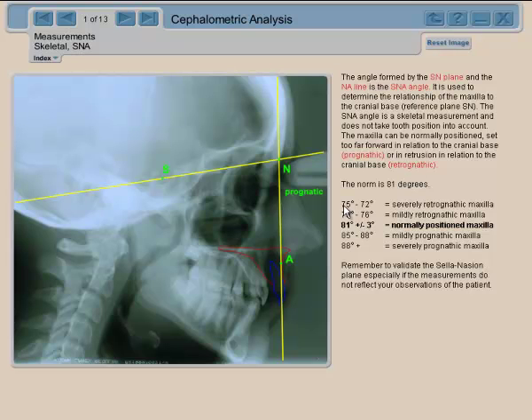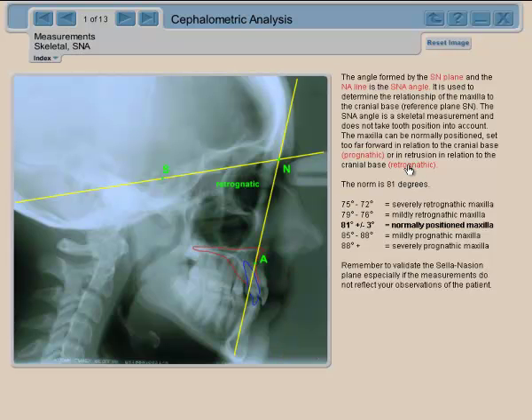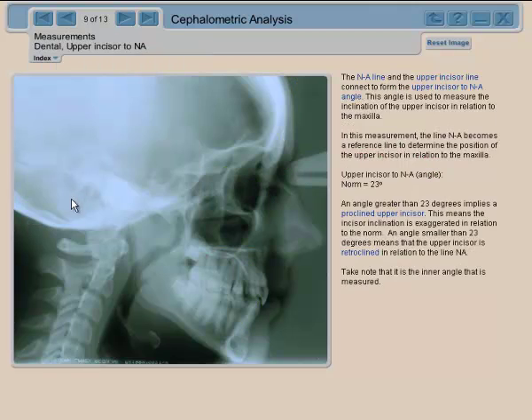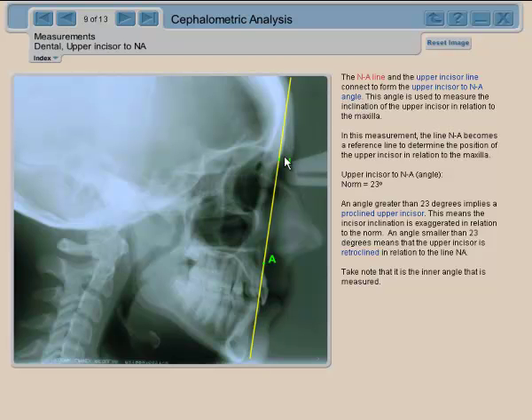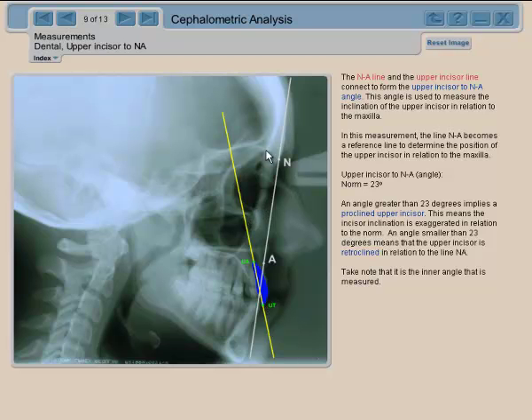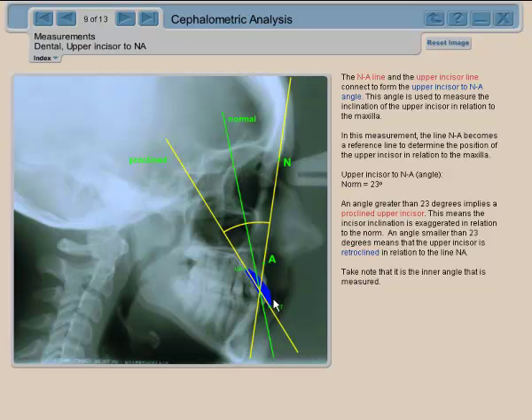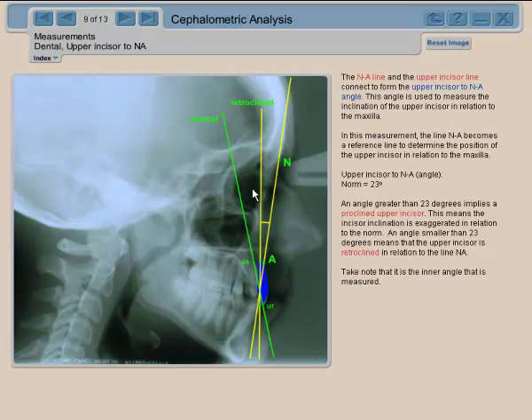If the SNA is smaller, you have a retrognathic maxilla. We can also use measurements from Steiner using the NA line as a reference plane. We bisect the upper incisor to obtain a line, and this measures the upper incisor to the NA line. If the angle is larger than the norm, the tooth is deemed proclined; if smaller than the norm, the tooth is retroclined.